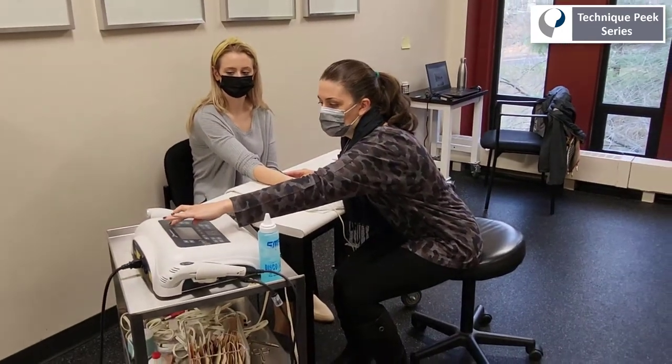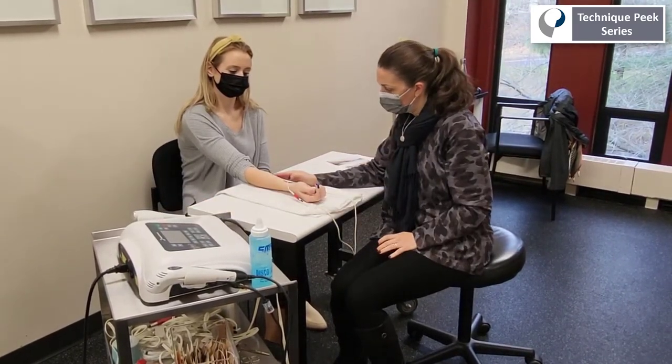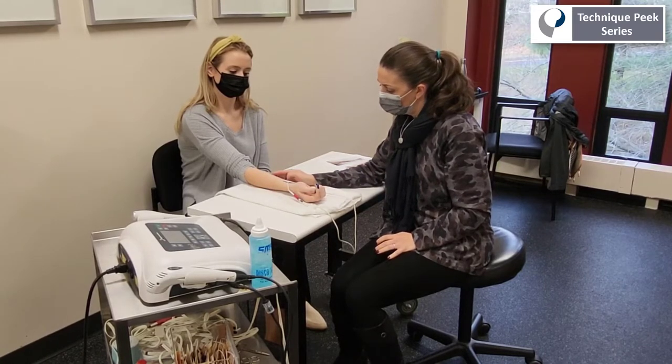So here we're going to take a look, turn on the machine, slide around that active pad, and look for IP joint flexion.